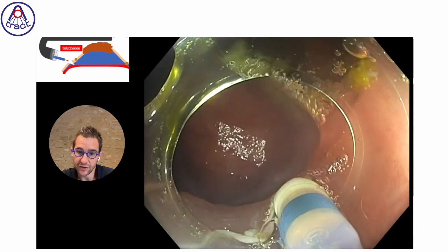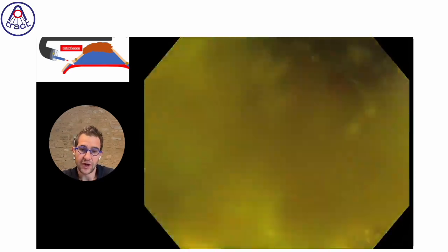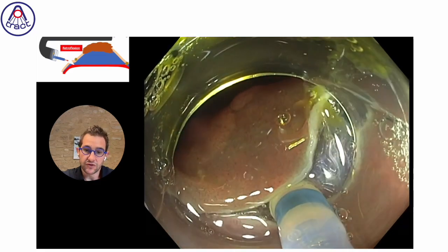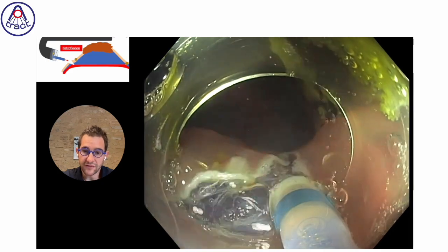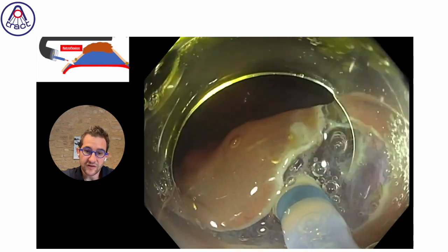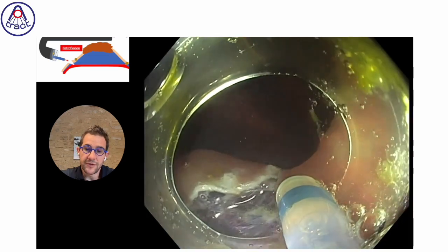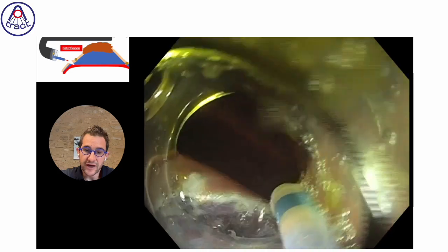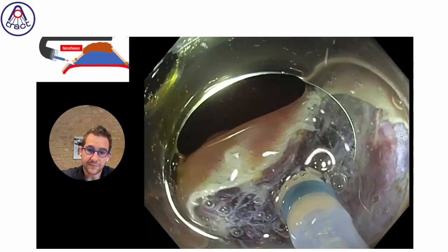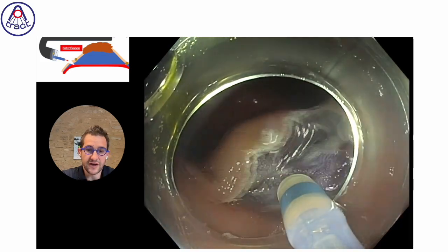And immediately after, I increase my trimming to enlarge the space and set up the traction positioning. If you have not done your trimming, it's more difficult to set up the traction device, because you can catch the muscle or you can catch the other edge during your traction device setup. So before putting it, please try to open the space by doing a relatively good trimming. In fact, you will save time by doing it before placing the traction device.